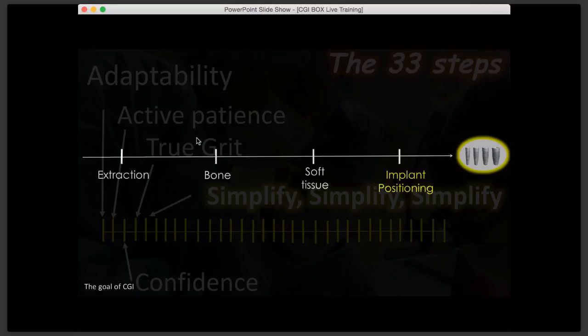Make sure there's not too much scatter or no scatter next to the implant site, because again, if you have an inaccuracy in the DICOM data, then these inaccuracies are going to trickle down. And only when you have good STLs, good impressions, then you can plan your implant in surgical position.